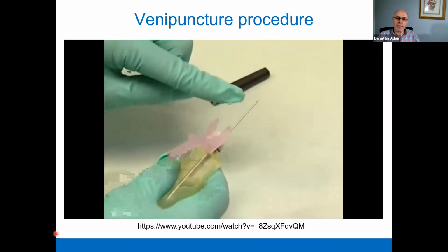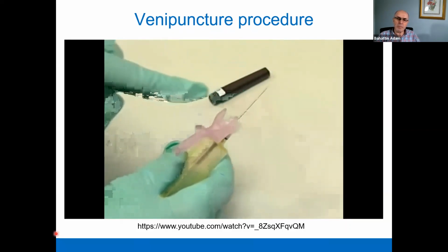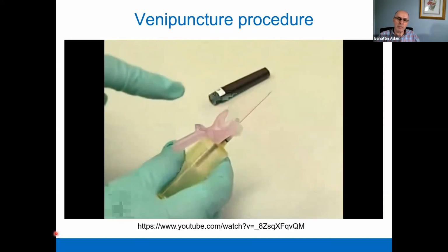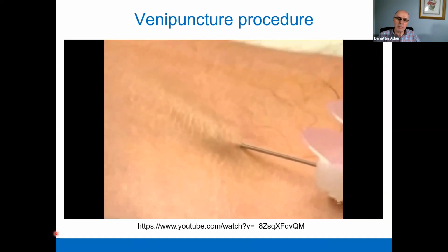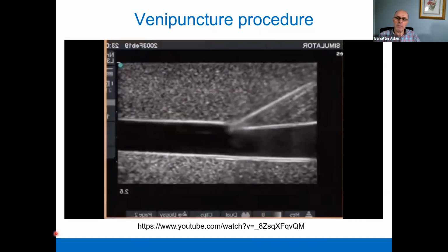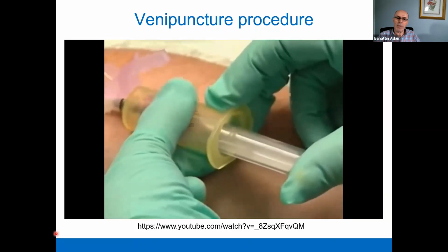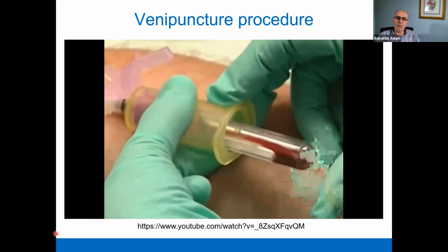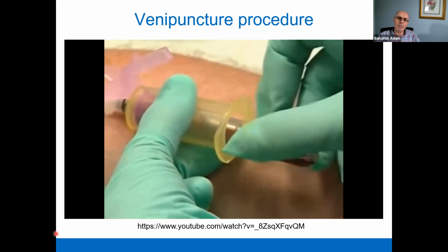You'll see that the hole in the beveled edge of the needle is facing up and is in line with the needle guard. Take a shallow approach to the vein, and the blood flashing back into the vacutainer confirms you're in. If you don't see the flashback, stop.